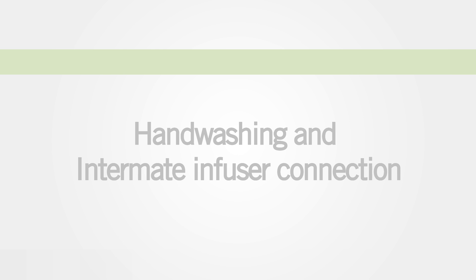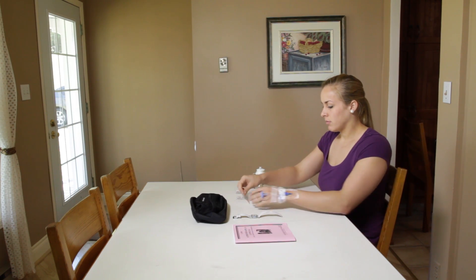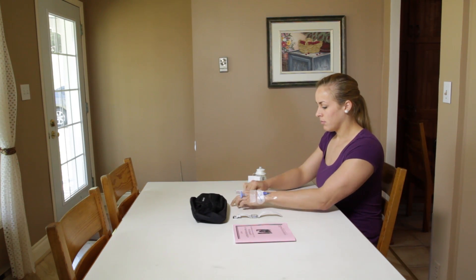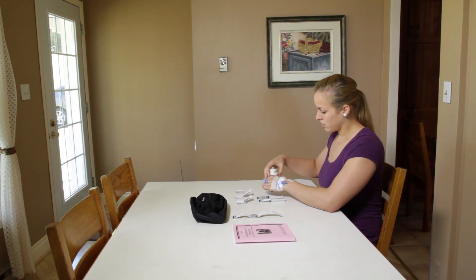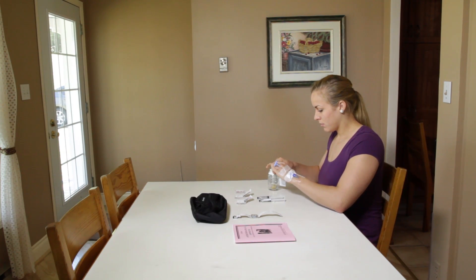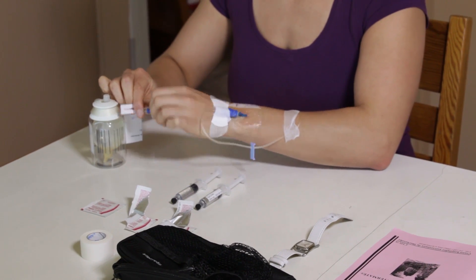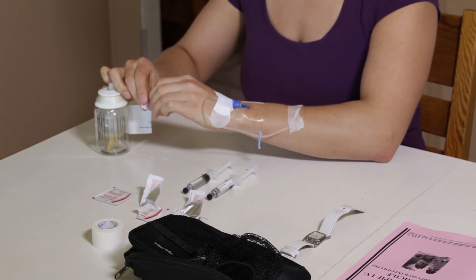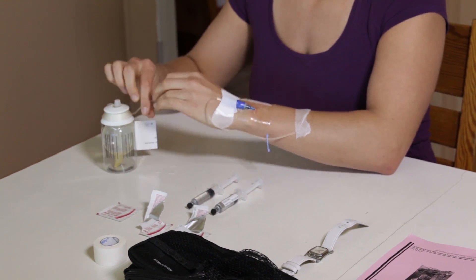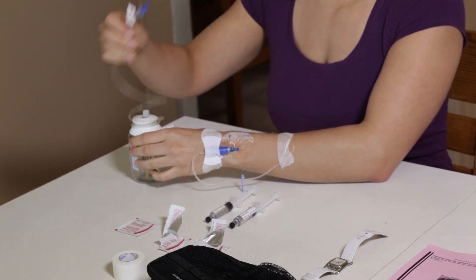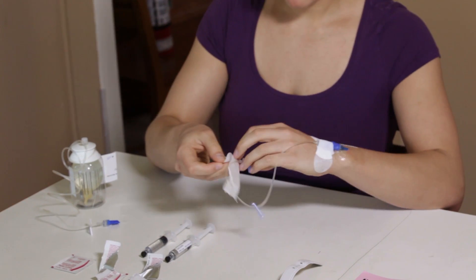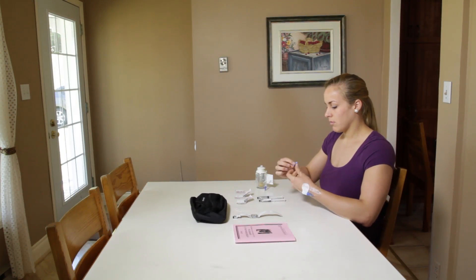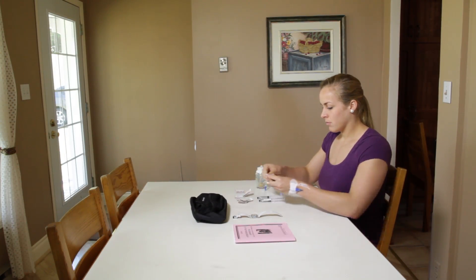Then sit down comfortably near the clean work surface and stretch out your arm. Open two alcohol swab packages. Open the infuser's tube clamp, wait until you see a drop of liquid, then close the tube clamp. Unroll the tubing. Remove the tape on the extension tubing from your intravenous catheter and hold the extension tubing in your hand.